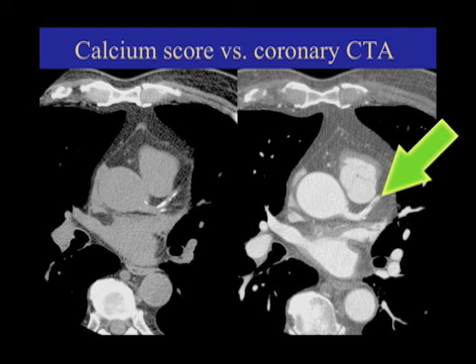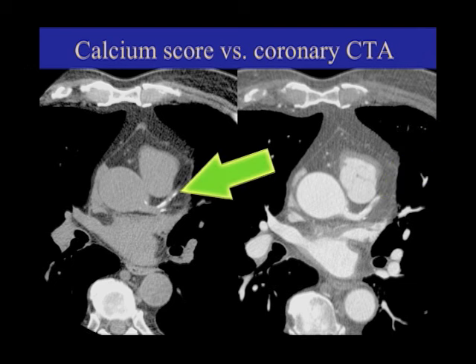You can see how you can really see the inside of that vessel much better here than you can here. This is actually the same patient, at exactly the same level. This dense stuff — when you don't give contrast, the densest, whitest thing you see is calcium.